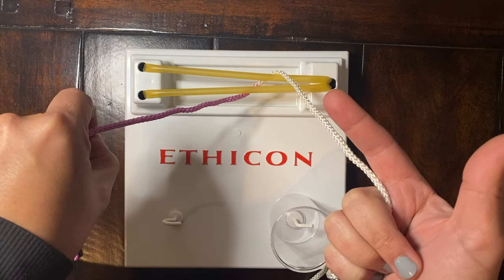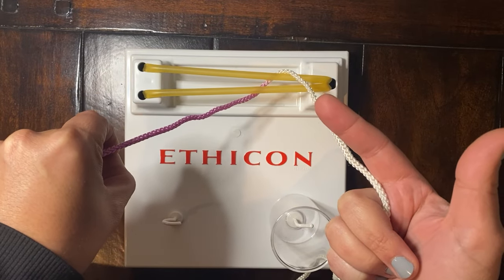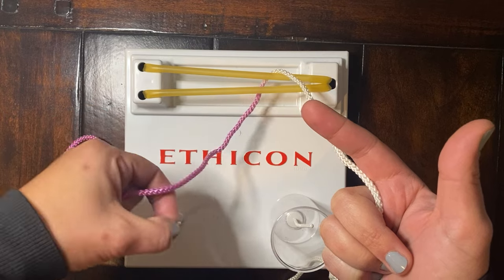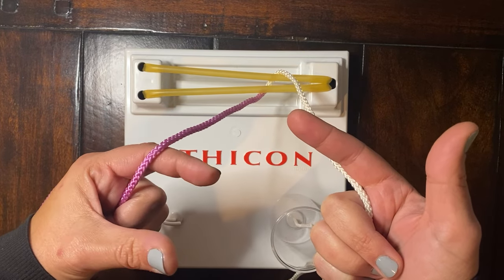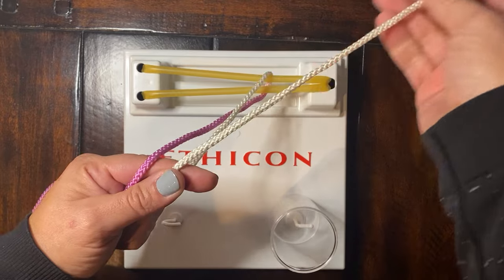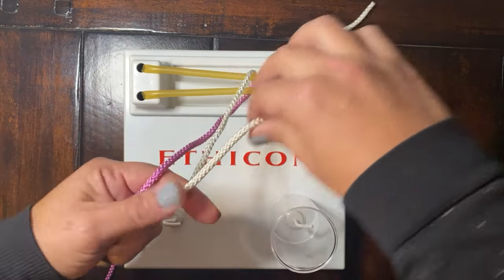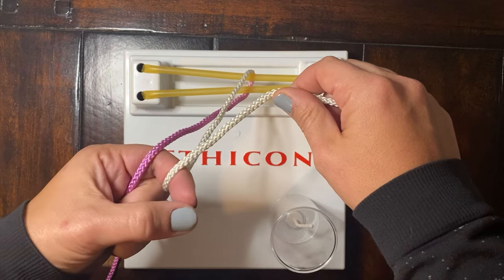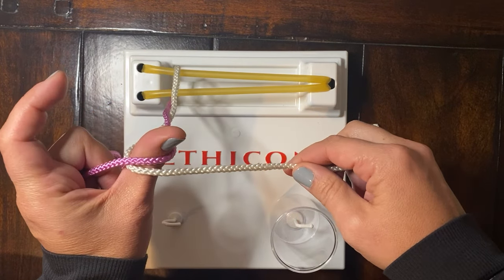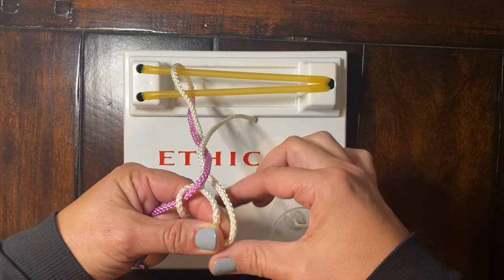To start, we're going to use the left hand to come over and make a ring around your left strand. It doesn't matter if you start towards you or away — we'll alternate — but I tend to start towards me. To do that, we rotate the hand towards you, open the ring, and pass our other loop in the opposite direction, because the white end goes away and the purple strand is coming towards you. Once we pass over, we'll close our ring and rotate the ring through the strands, then open the ring one more time to pinch the free end of the suture, rotate back, and pull the white end away from you.